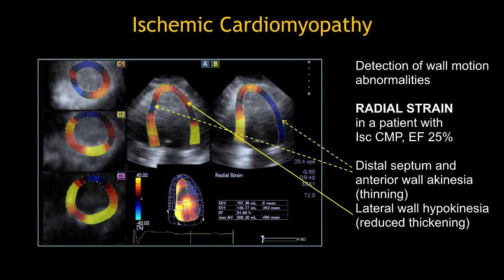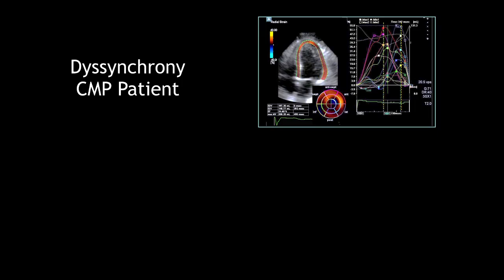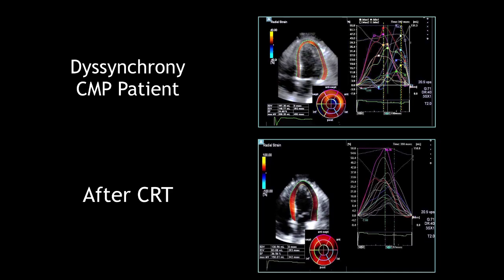Here is a patient showing a lateral infarction with some anterior wall hypokinesis. When patients develop significant LV dysfunction — whether ischemic or non-ischemic — dyssynchrony contributes a great deal in many with heart failure. The dispersion of the curves clearly shows lack of synchrony compared to normals. Here is the same patient after CRT, showing improvement. We can also gauge the efficacy of therapy such as CRT using this approach.